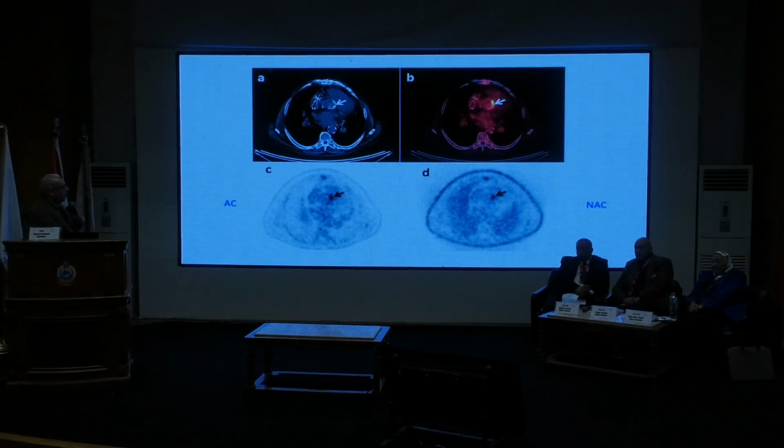Another case of a positive image for infective endocarditis. The uptake here is not diffuse around the valve, it's localized in one area, present in the AC and in the non-AC image.